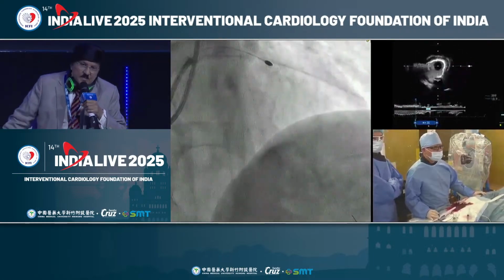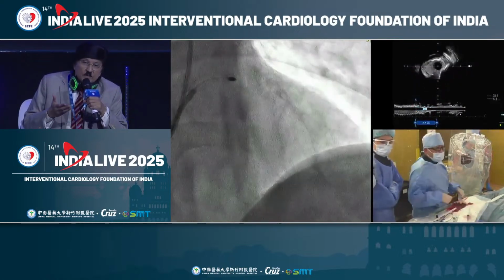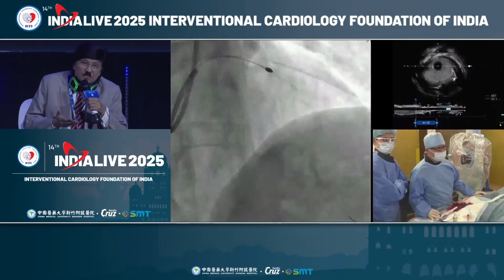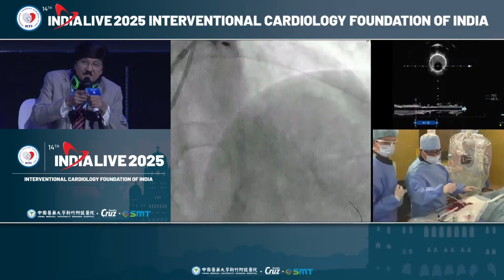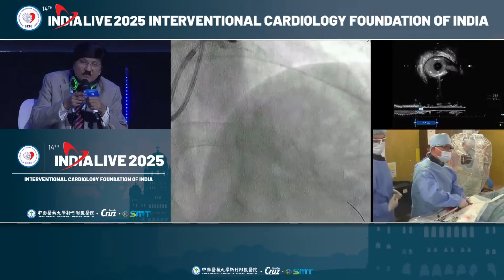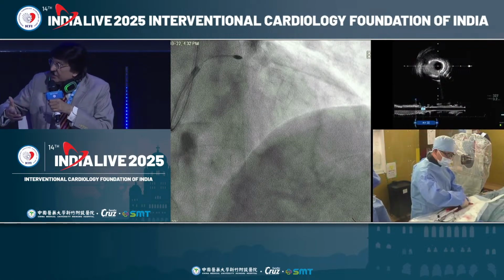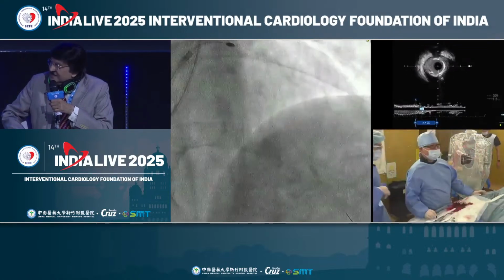So Professor Kashima, what is your threshold to use IVL here instead of going to a 2.0 rotablation, which is a bit more aggressive for people like us? In this case we would have gone ahead with IVL because there is still one arc of 270 degrees of calcium left behind. There is one shot where there was a 270 arc of calcium without any crack. Yes, if I had the luxury of going to IVL, I would have gone for IVL. Okay, this is a good option.